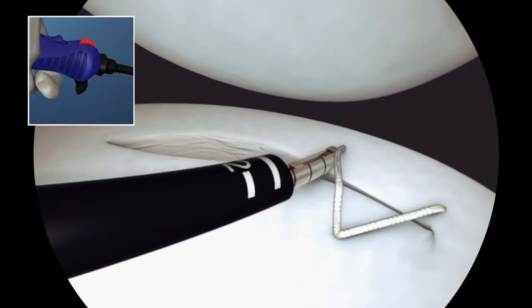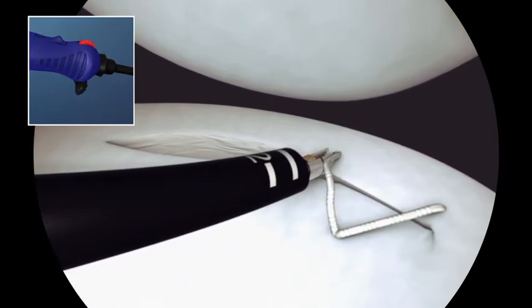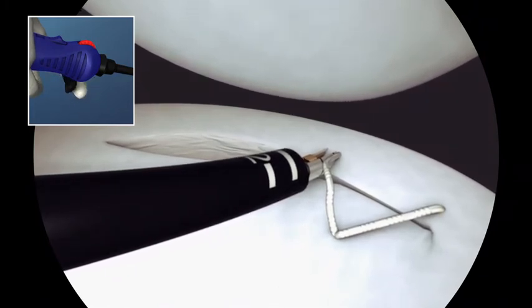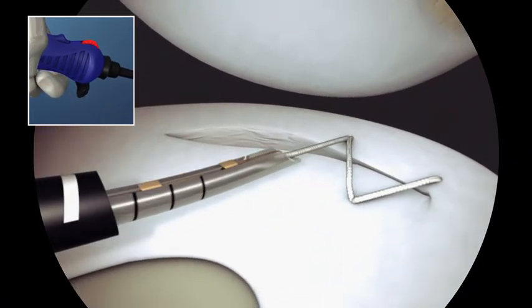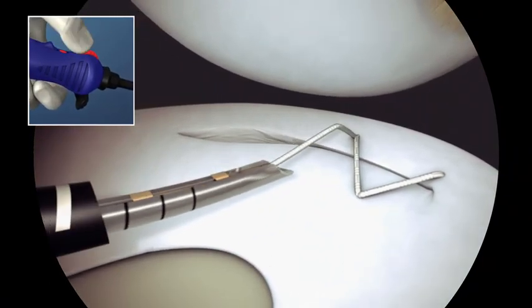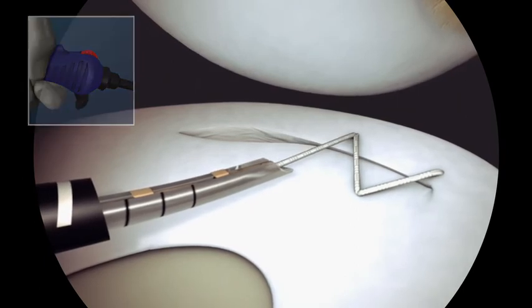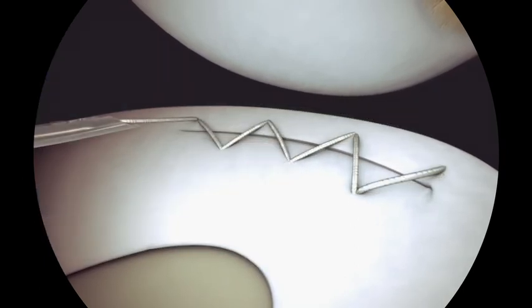Pierce the meniscus. Rotate the device twice. Advance the trigger to reset. Pull and release the trigger to deploy an implant. Withdraw the needle from the meniscus and tension the stitch. Continue creating sequential stitches until the meniscal running repair is complete.